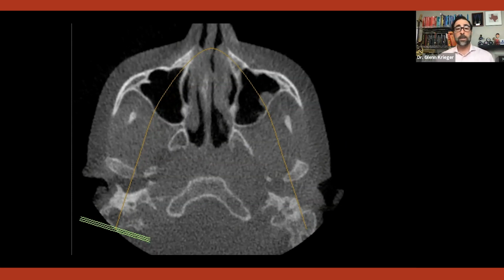But at the end of the day, look at his nasal septum. Now, you might say, well, what do I care about this for? But if we're really going to walk the walk and not just talk the talk about caring about our patients, if I can spot this and see this in a child, and it's more than just orthodontics, and maybe get my ENT involved, my airway-centric ENT, that's the name of the game.